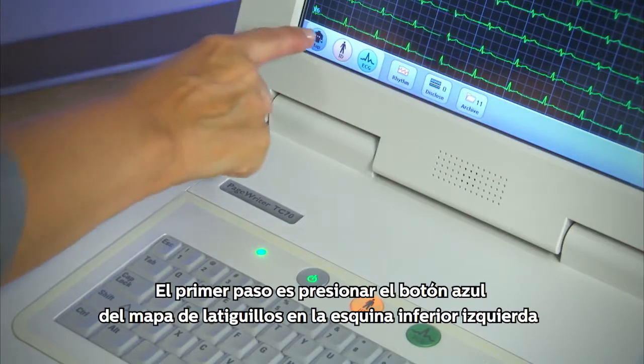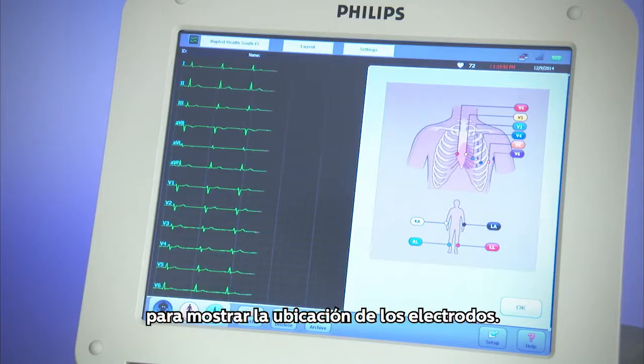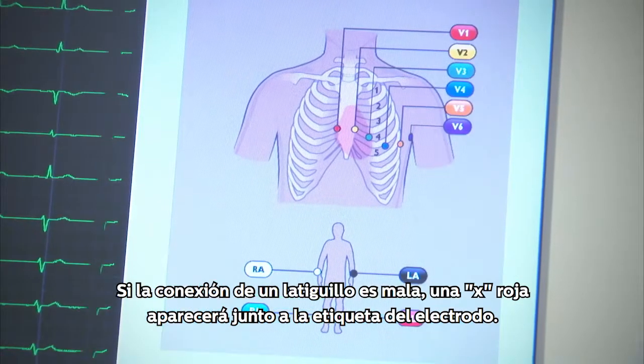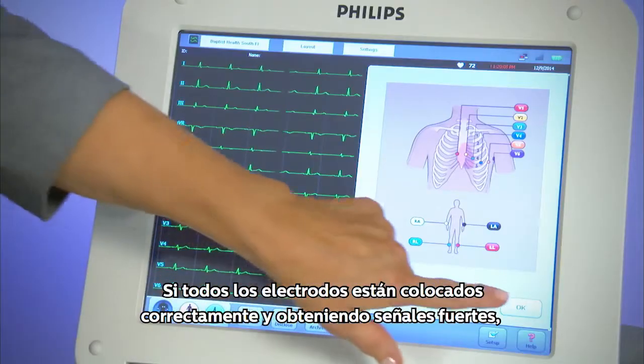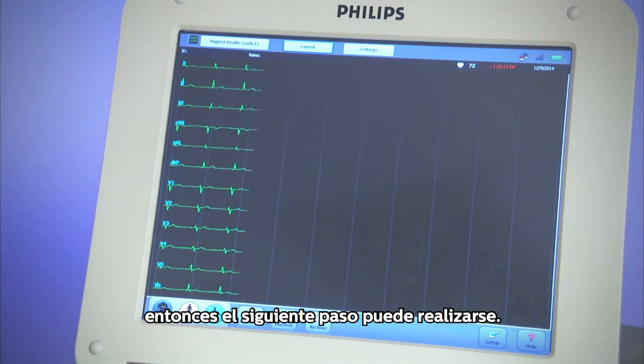Step 1 is to touch the blue map icon in the lower left corner to display the lead placement locations. If a lead connection is bad, a red X will appear next to its lead label. If all leads are correctly placed and picking up strong signals, then the next step may be performed.